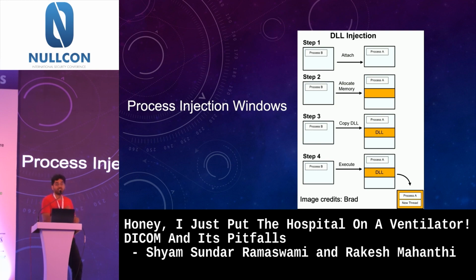So what this malicious DICOM does is, it says, hey, I actually know you are the DICOM viewer, can you just give me a small space in your process? So it writes its bad section of code into a running process and turns that into bad. Now this is the attack that we call process injection on Windows, which justifies the talk that I'm going to take control of the entire hospital. And honey, we just take control of the entire hospital.